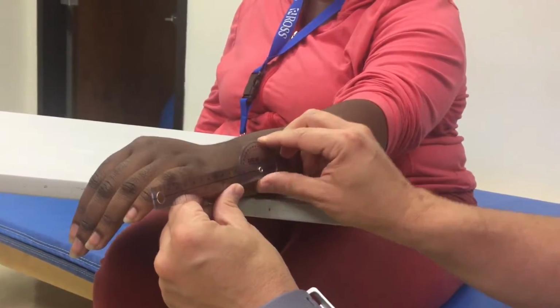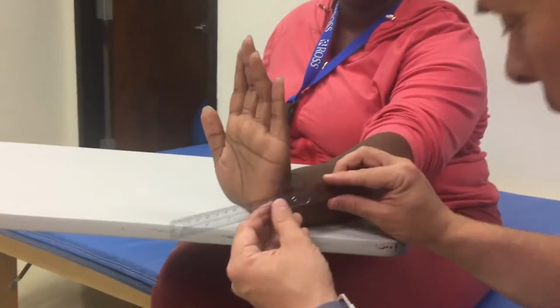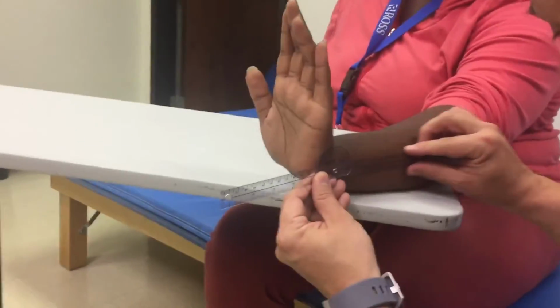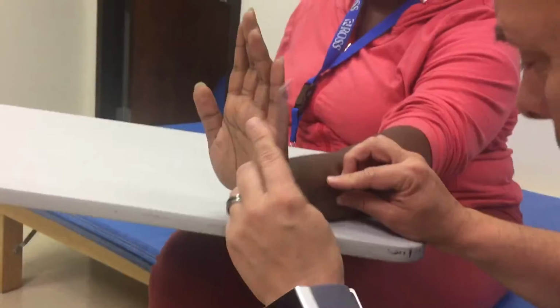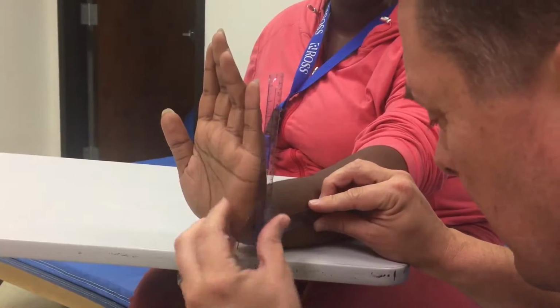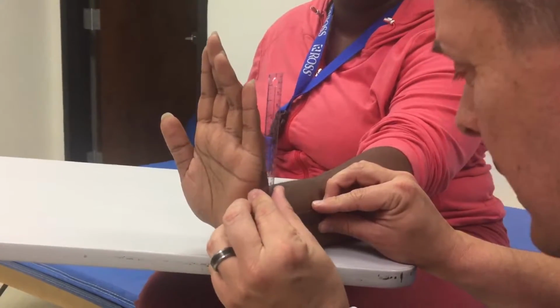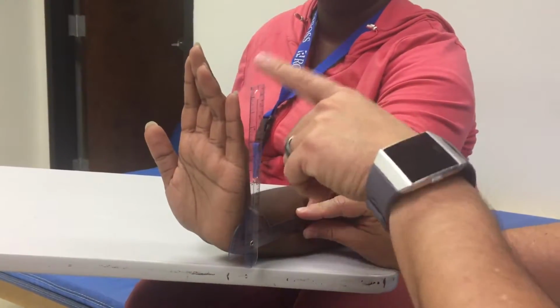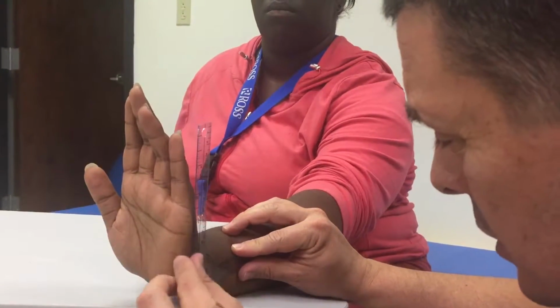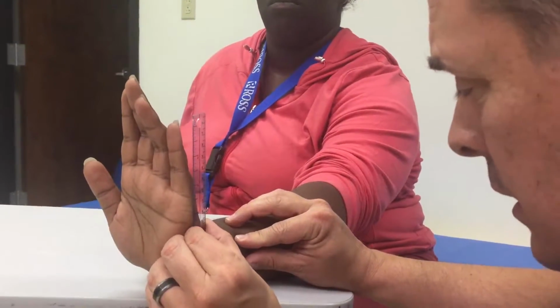Okay? Good. So now I'm going to have her lift her wrist up or back like that. So then distal to the ulnar styloid process, the stable arm is still lined up with the middle of her forearm, and the movable arm is going to be lined up with her fifth metacarpal right there. Now, not the ends of her fingers, because you can see the ends of the fingers go back a little bit further. So you want to make sure that it's lined up with the fifth metacarpal right there.